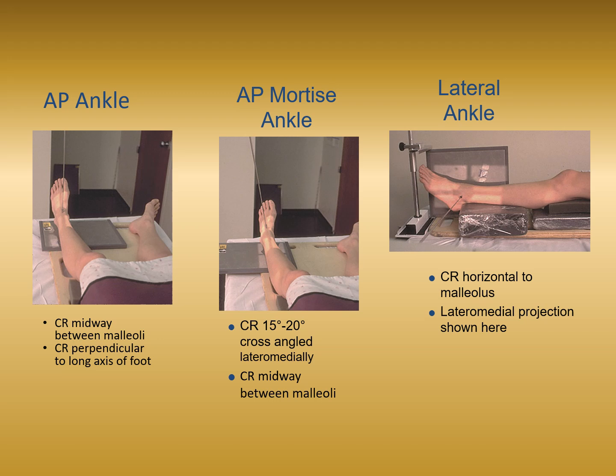All right, central ray is horizontal. This is a lateral medial projection because it's entering on the pinky side, see the pinky toe. It's the lateral side of the foot. All right, so entering the lateral malleolus. It's a lateral medial projection. Cross table lateral ankle.